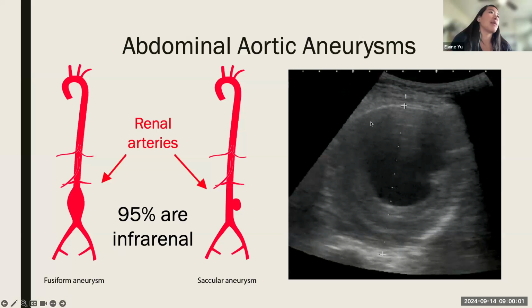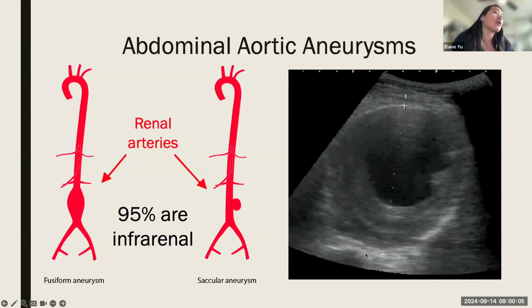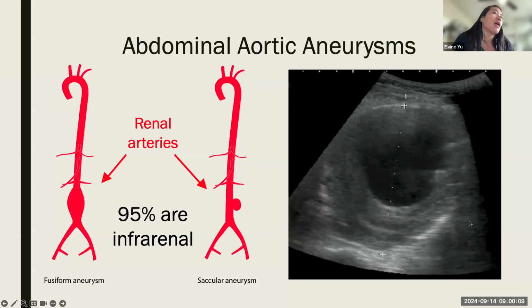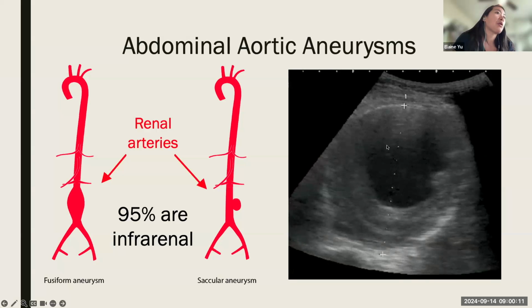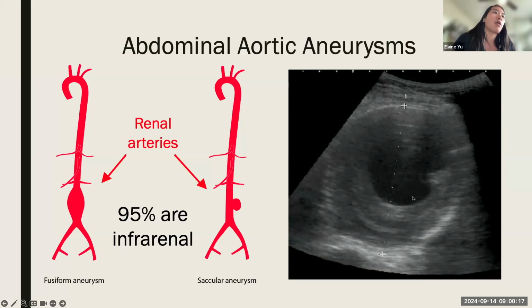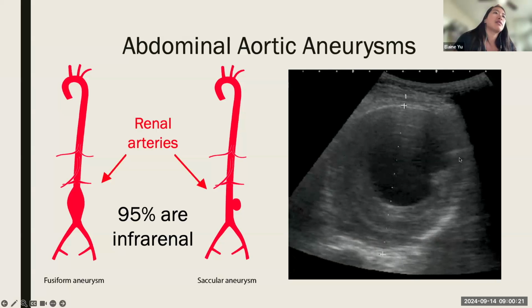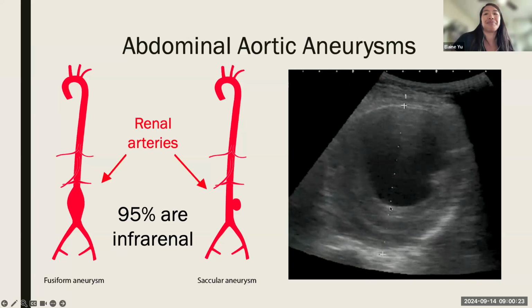And here's just a clip of measuring the aorta from outer wall to outer wall. So identifying that hyperechogenic outer wall, even though the hypoechogenic inside where the actual fluid and blood is flowing is much smaller. And then all of this around that is clot, dissection, etc.